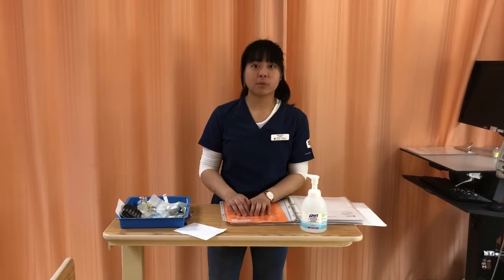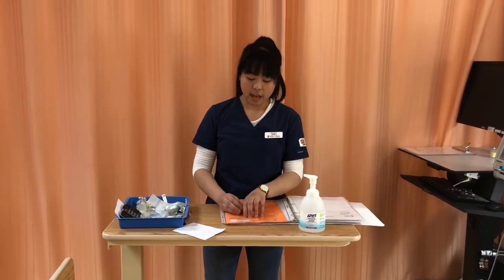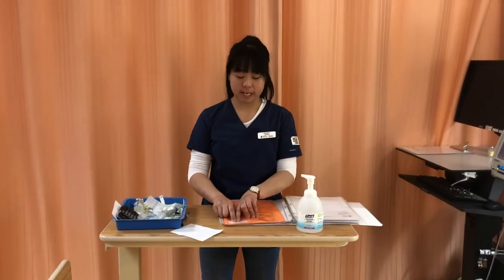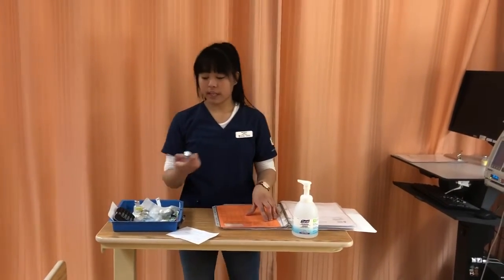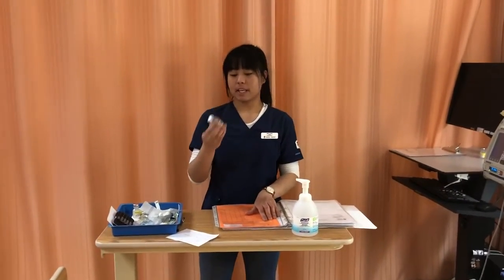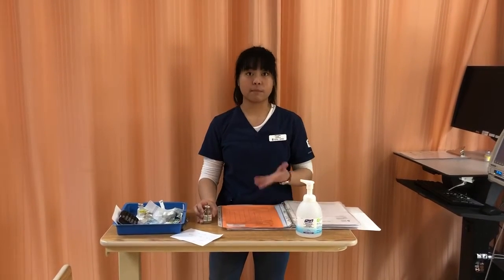So I have my MAR here, which I already compared with my doctor's order, and I have my patient here. Her name is Frida Fritz. She was born on June 4th, 1963, and she has no known allergies. And I also already collected my medication, which is Penicillin G, from my Pyxis.